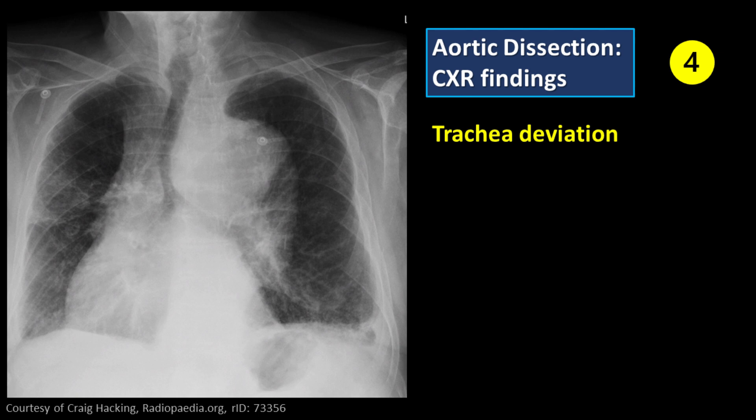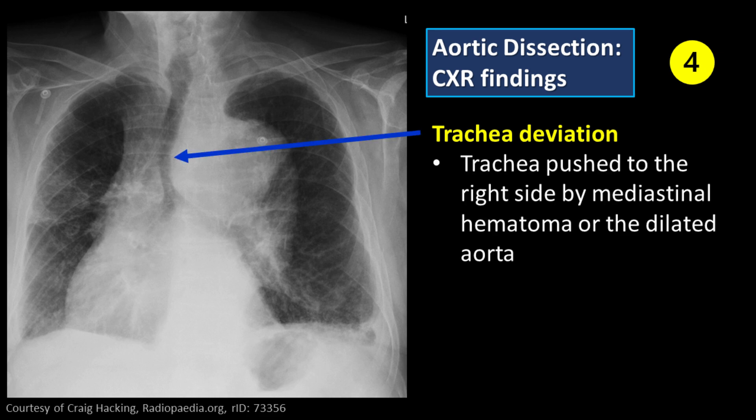Feature number 4: Tracheal deviation. The trachea may be pushed to the right side by mediastinal hematoma or the dilated aorta.